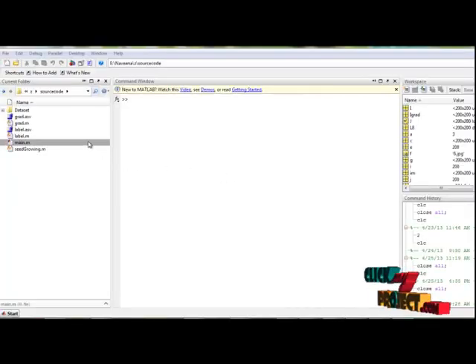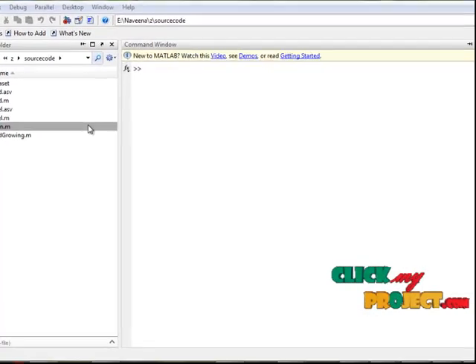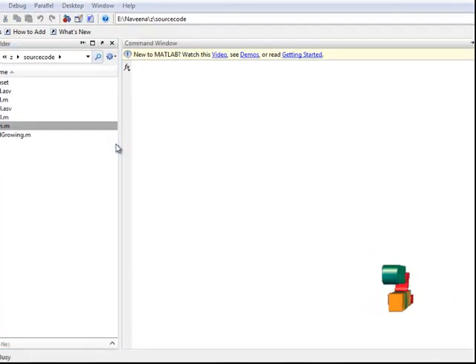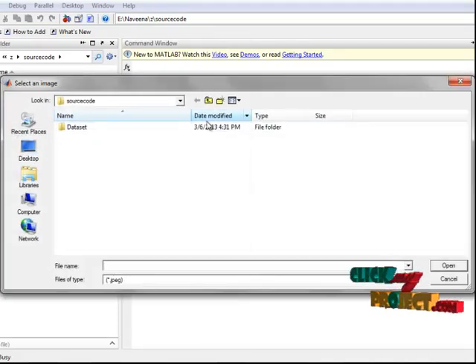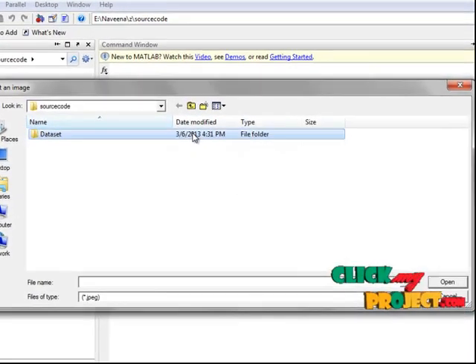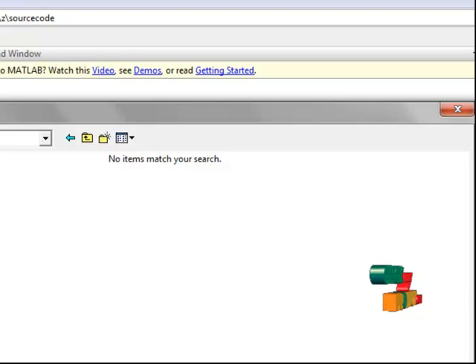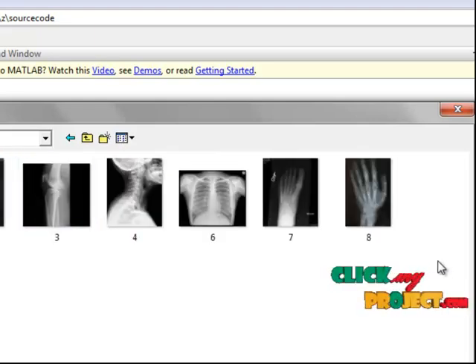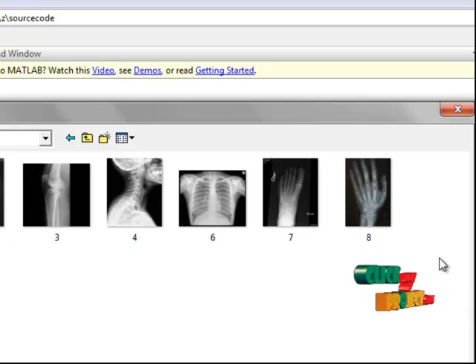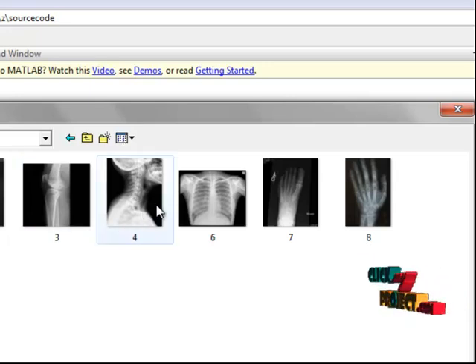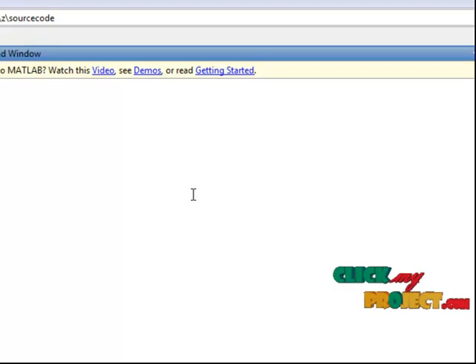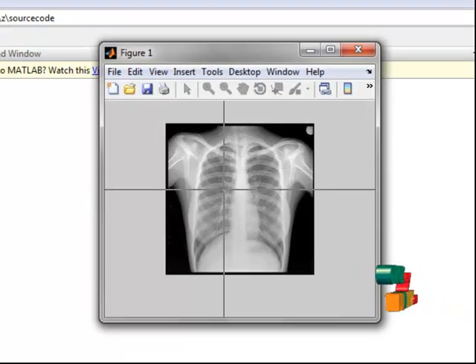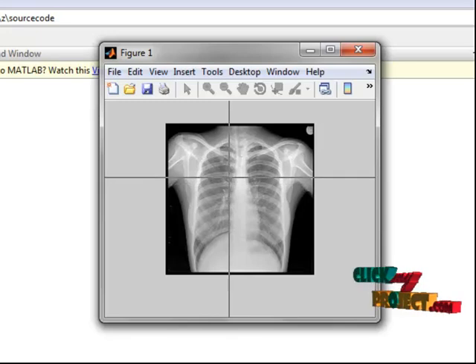Now let us see the execution of the program. First, select the main dot M file and click run. This is an open dialog box — this is the dataset. We can select any of the X-ray images. Select one image and see the output, then select the seed point in the input image.